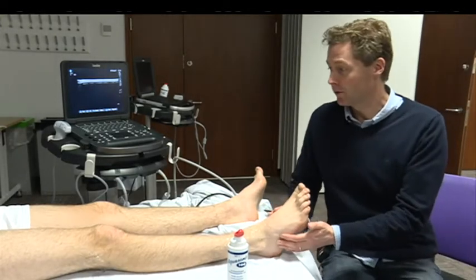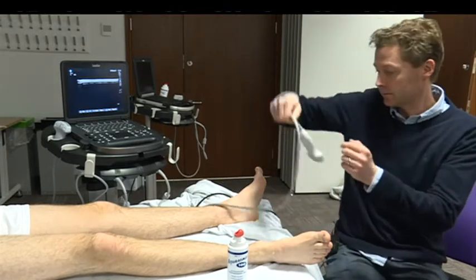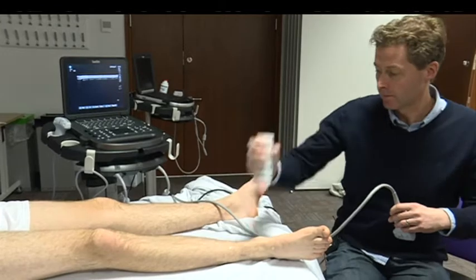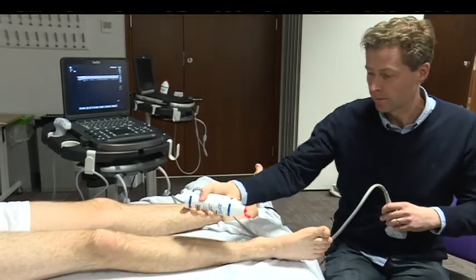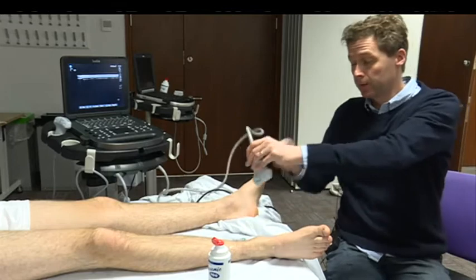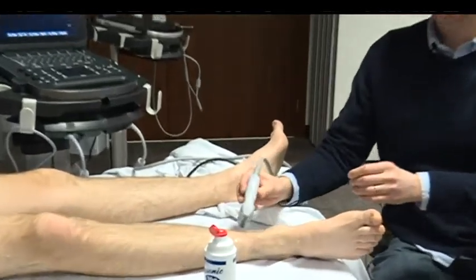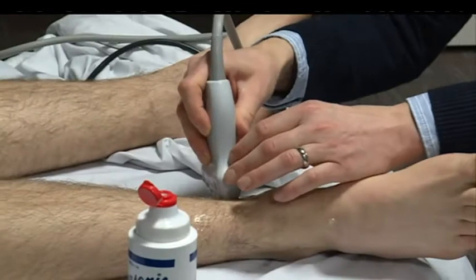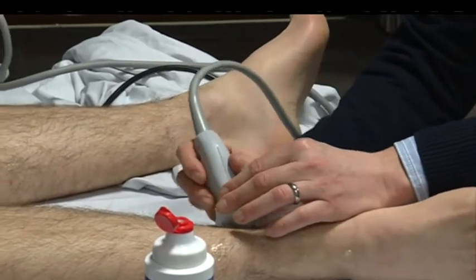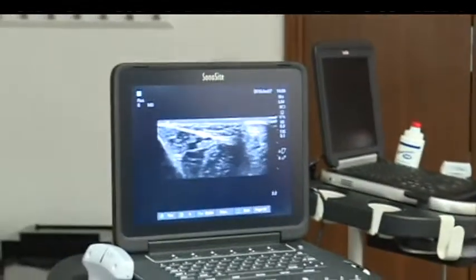Starting with the tibial nerve first — rotate your leg out. This is the biggest nerve; it supplies the medial border of the foot and the sole of the foot. The left hand side of the screen is anterior and the right hand side is posterior.